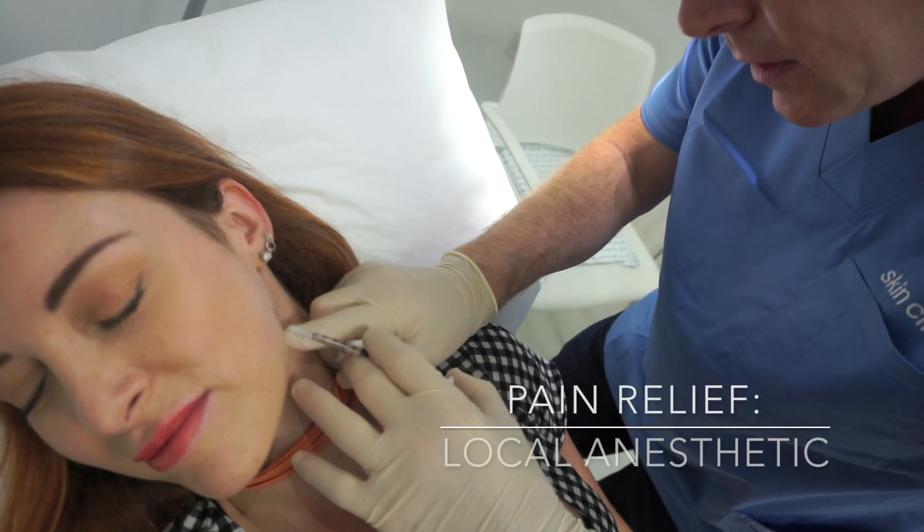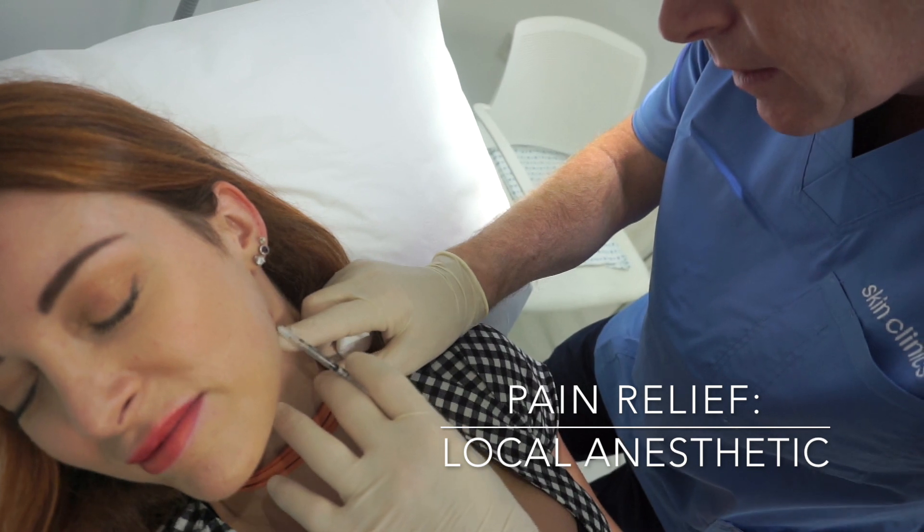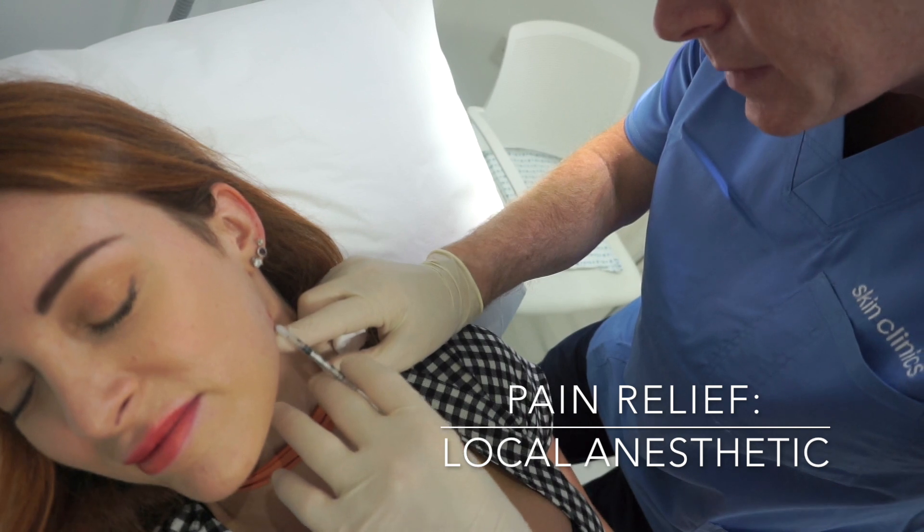All this does is give a little numbing to the area. You can see it's a tiny needle — it just goes in under the skin. That'll be numb in about a minute.